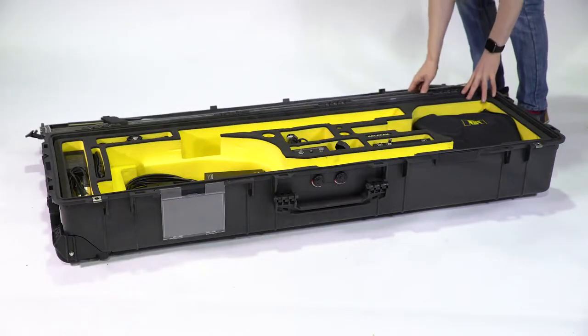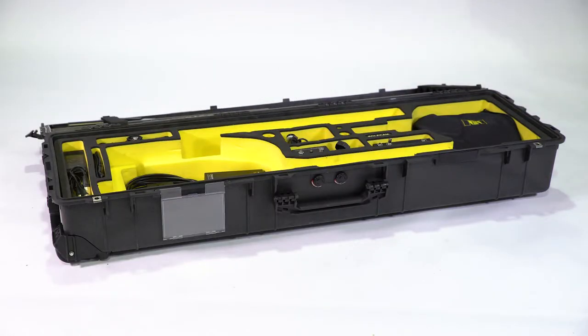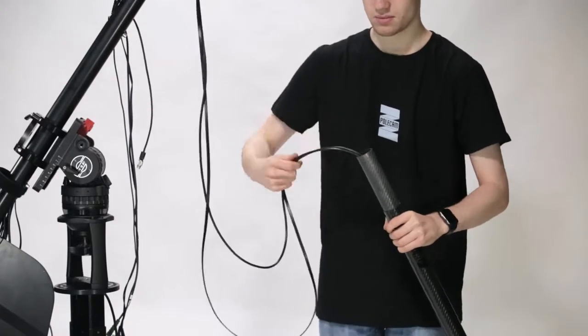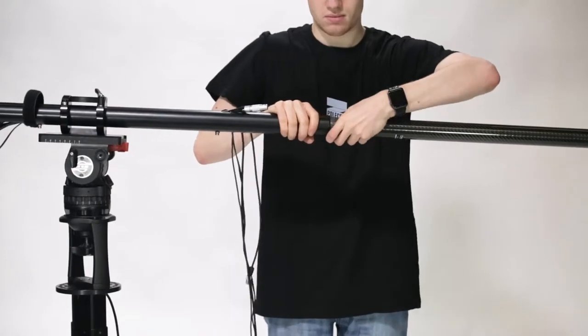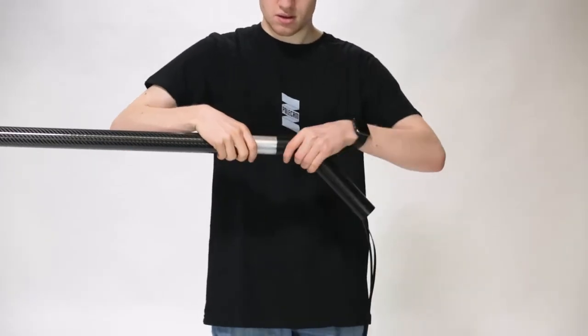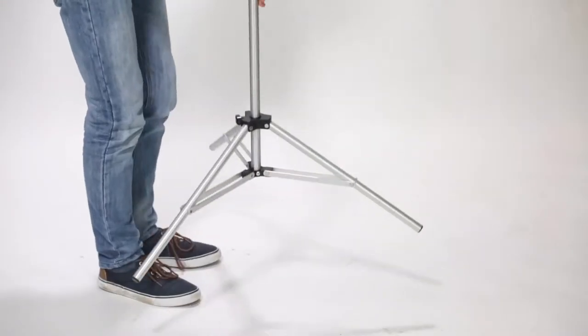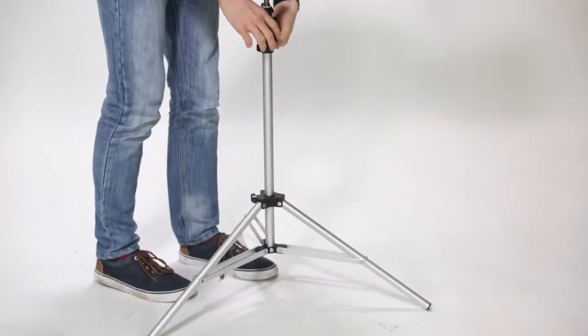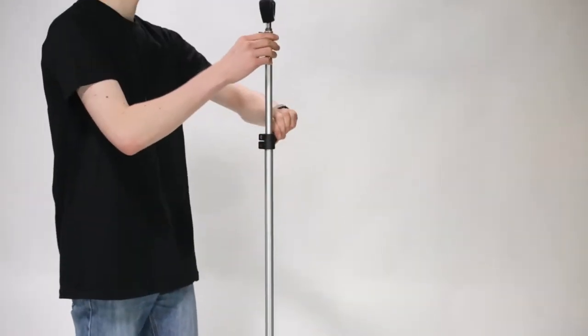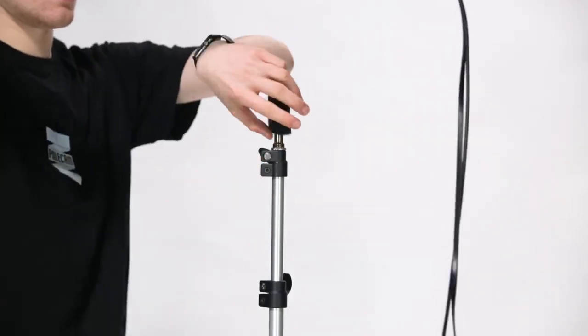Take the full-length carbon fibre pole from the case, hold it vertically, and drop the head and camera control cables down the inside. Repeat with the elbow. At this point we recommend you support the system with the rigging stand, spreading the legs to full width and putting the velcro strap around the elbow.